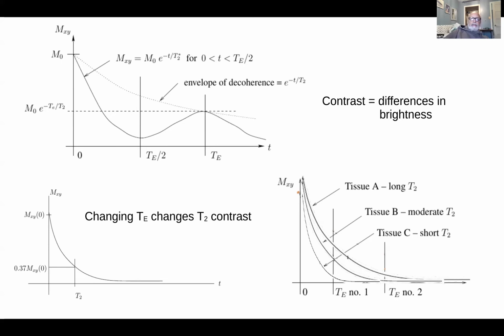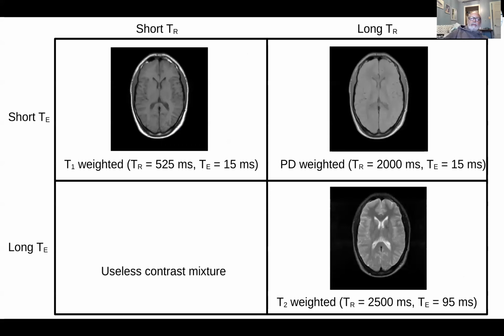So just to clarify something that I probably didn't say quite correctly first. So this is your T1 weighted situation, short TR. So to get rid of T1 weighting, you want your TRs to be very long, 2 seconds or more. And so with this, there's no T1 contrast. And if we keep TE really short, there's also no T2 contrast. So all that's left is the density of the protons. And so this is called proton density weighted.